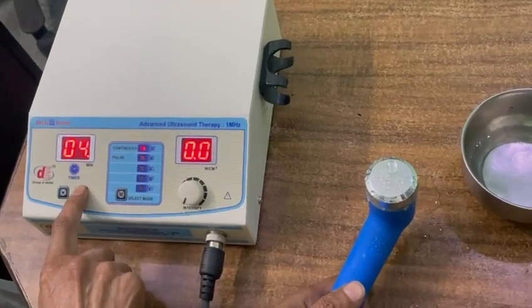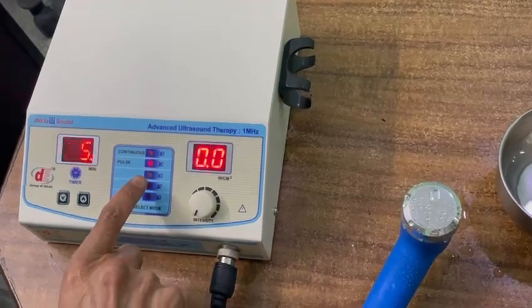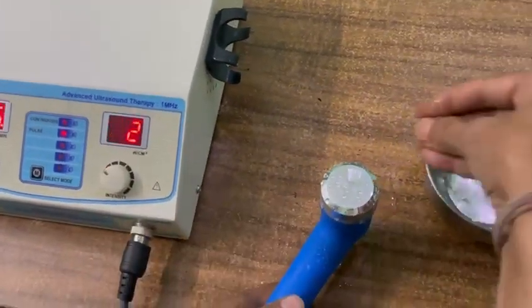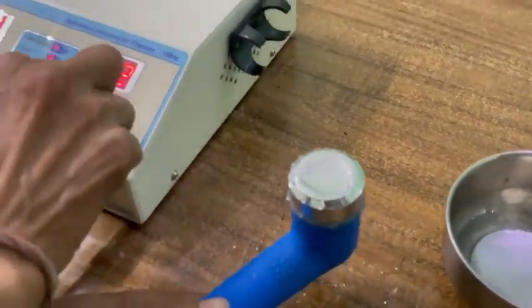Set the time — 3 minutes, 4 minutes, 5 minutes. Select pulse mode. 1 is equal to 1. Simply increase the intensity. Now it is working on pulse mode — you can see.